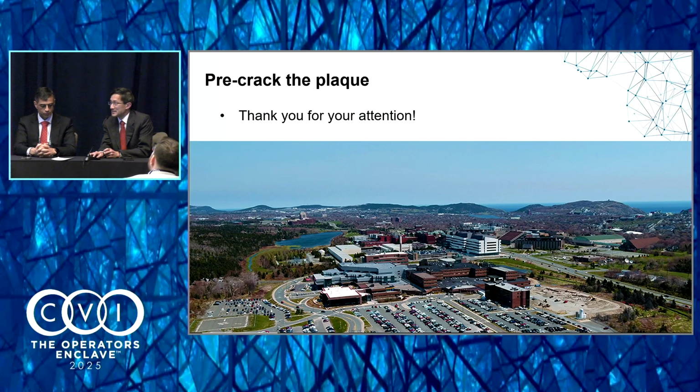Thank you, Allison. Just to highlight the cost effectiveness, the OPN balloon is listed as $1,200, whereas your Shockwave is $4,500, and your Rota is about $3,800.